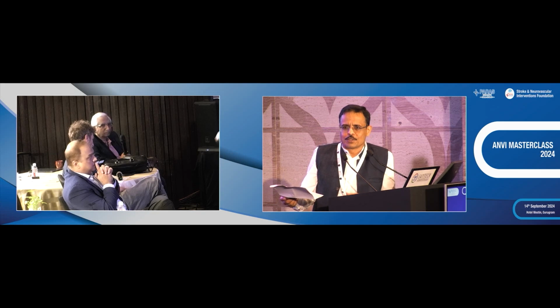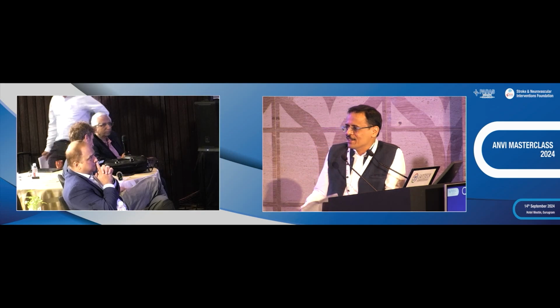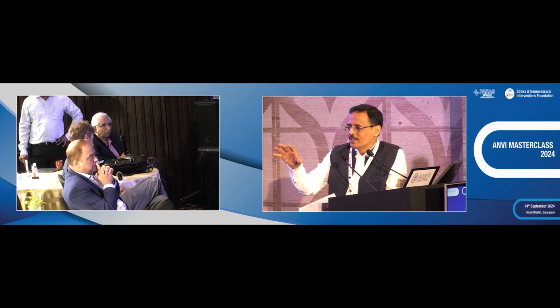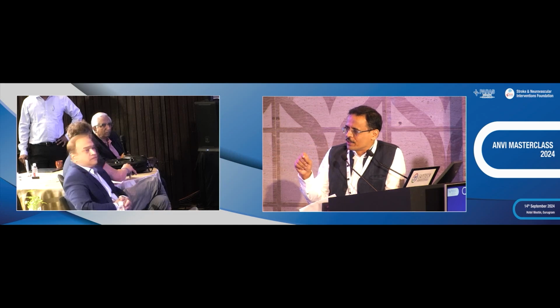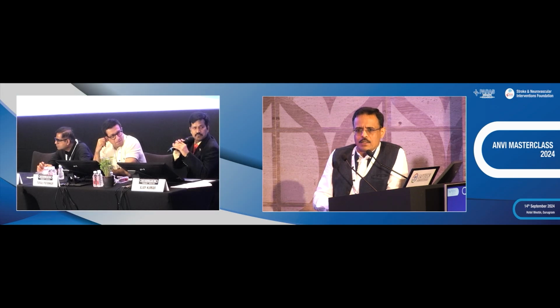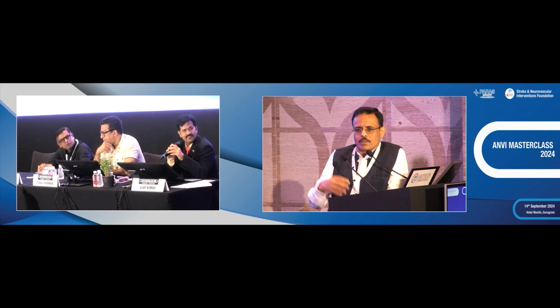I'm sorry, guys. We'll have to just carry on. To me, the only question in this case was, we can just have a voting here. Should we have used a balloon-mounted stent instead of the self-expanding? Ajay, balloon, self-expanding? This one, the case which we showed. I honestly feel that it doesn't make a big difference. Seriously, no difference.